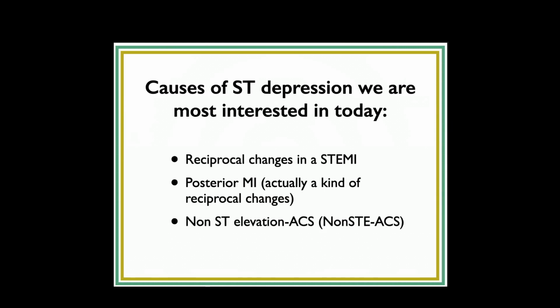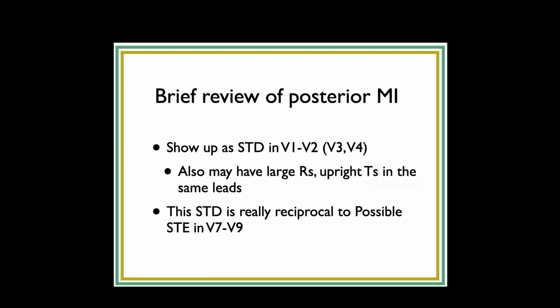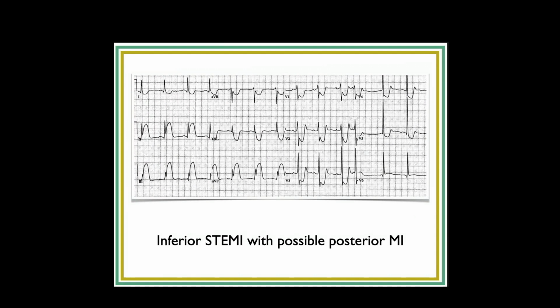Okay, so that's it for our re-examination of reciprocal changes. This part is going to be pretty short. Not much new here. I think that's all old. Typically, we see, yeah, this is one where there's nothing subtle about this one. Possible posterior, we can see it here.